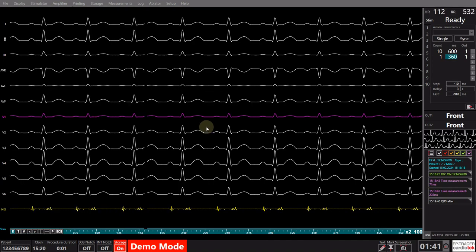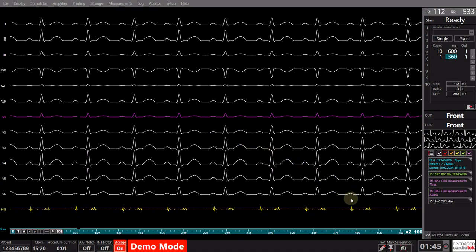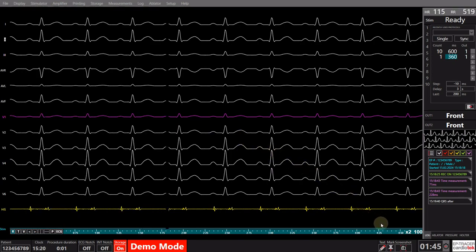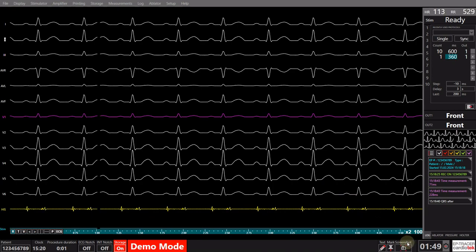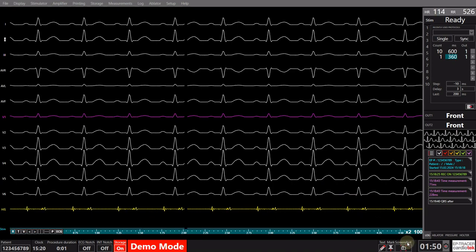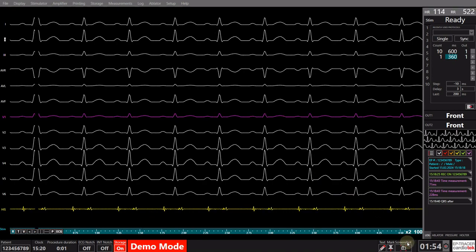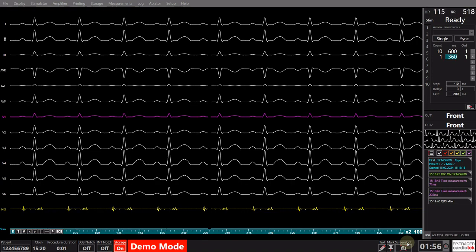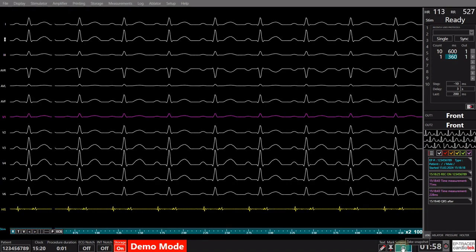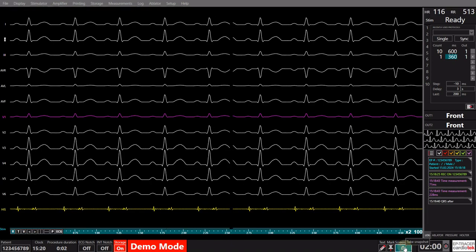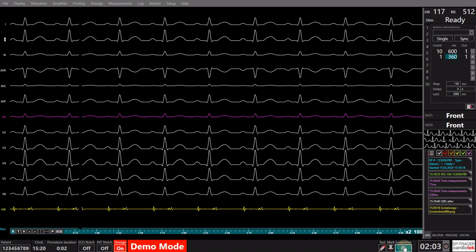Documentation can be further enhanced by incorporating screenshots that visually depict various measurements, or illustrate a comparison between the QRS width before and after. Capturing a screenshot is a straightforward process — just click on the button situated in the lower right corner of the screen to effectively capture and integrate visual elements into the documentation.